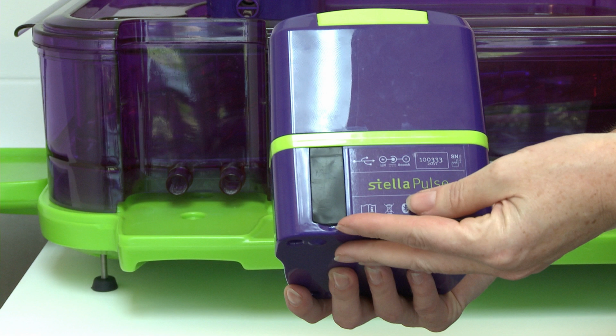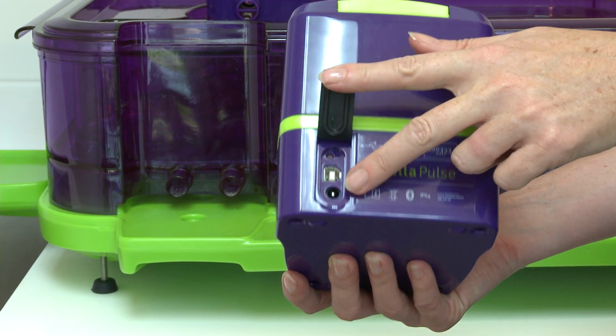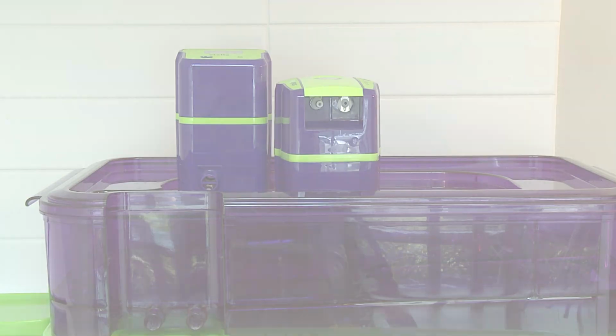The power port for charging Stella Pulse is protected by a black power cover. Before using Stella Pulse, make sure that the black power cover is sealed securely so that no water or disinfectant comes in contact with the power charge port. To charge Stella Pulse, peel back the power cover to charge. Stella Pulse should not be charged whilst attached to the base or near any forms of liquid.